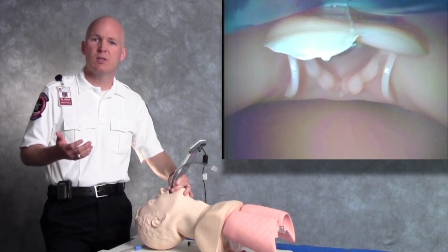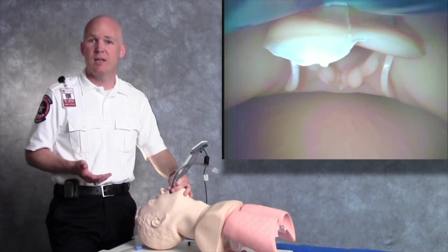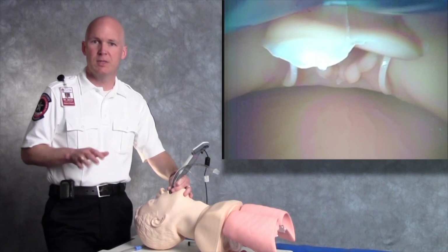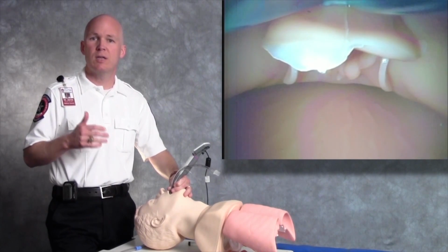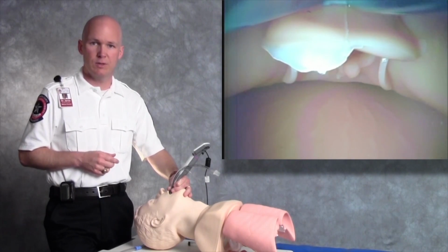So in retrospect, it turns out that this is something that's been known for quite a while. Dr. Richard Levitan has been teaching the value of epiglottoscopy. Hopefully he's been teaching how to pronounce that also. That's a tough word. Epiglottoscopy for years. And we found that doing this particularly is important with these non-displacing video laryngoscopes like the King Vision.